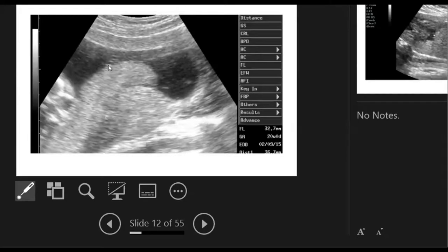The first thing you have to know is that this is your probe. This curved thing is your probe. This curved part of the slide is your probe, placed on the maternal abdomen. Immediately underneath the probe, we have the maternal anterior abdominal wall and then the uterine wall, the anterior myometrium. And if we go right round, we have the posterior myometrium. Are we together? So if it's not here underneath your probe and beyond the baby, it's in the posterior uterine segment.